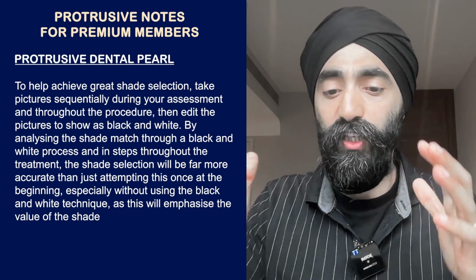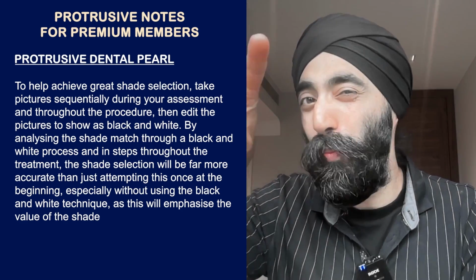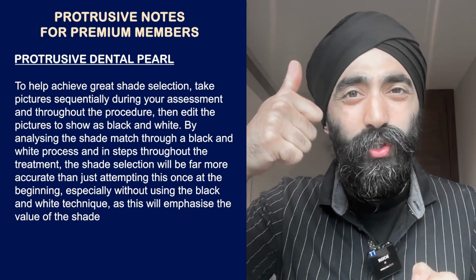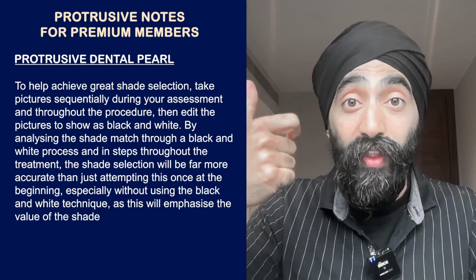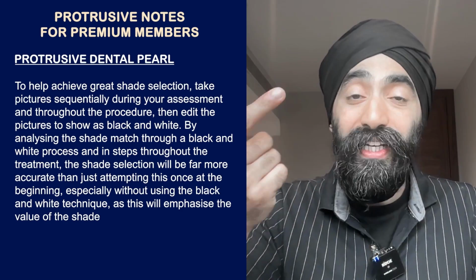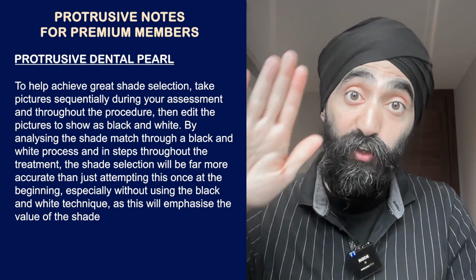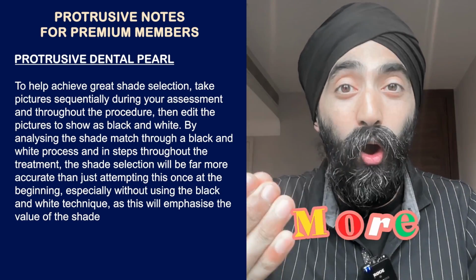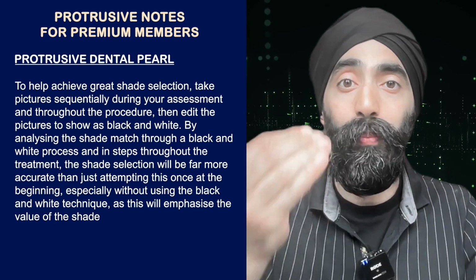What I mean by this is when you're actually painting on the different layers of composite, let's say using an opaque layer first, instead of just proceeding and looking at the end, why don't you take a black and white photo, or get your assistant to take a photo, even on their iPhone. Take a photo, quickly convert it into black and white, and have a look. Has that shade of composite that you just placed given enough value? Do you perhaps need to add a little bit more? It's valuable real-time data that you can get by the use of the black and white photo.